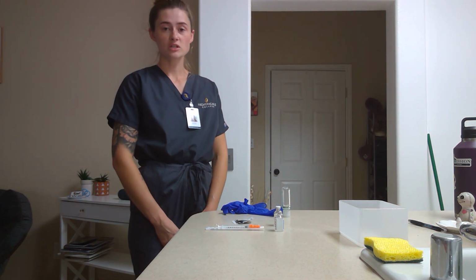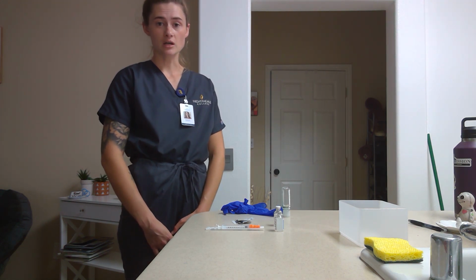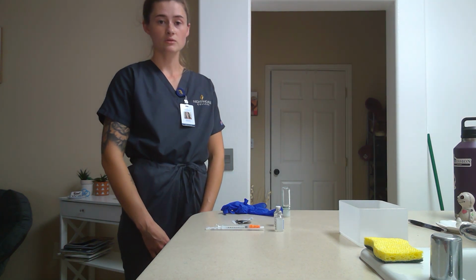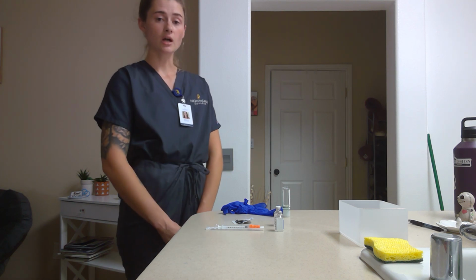For this video, I'm going to be drawing up insulin. I'm going to start by verifying that it's the right patient, drug, dose, time, route, and documentation. After I have verified that, I am going to make sure I have all my supplies ready, and I'm going to verify the medication with the electronic health record.